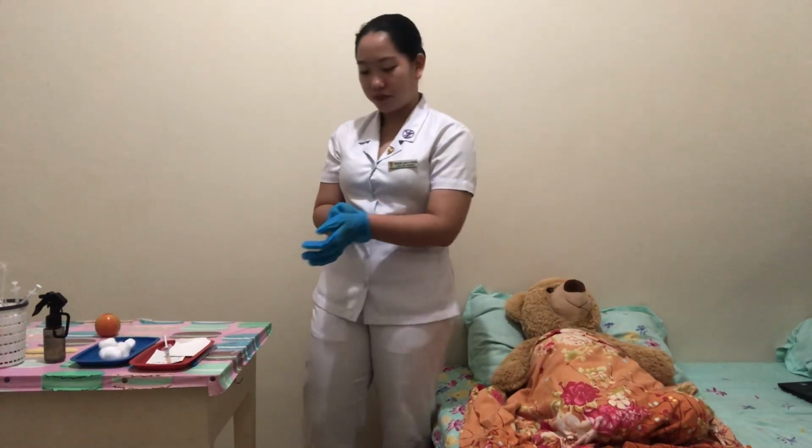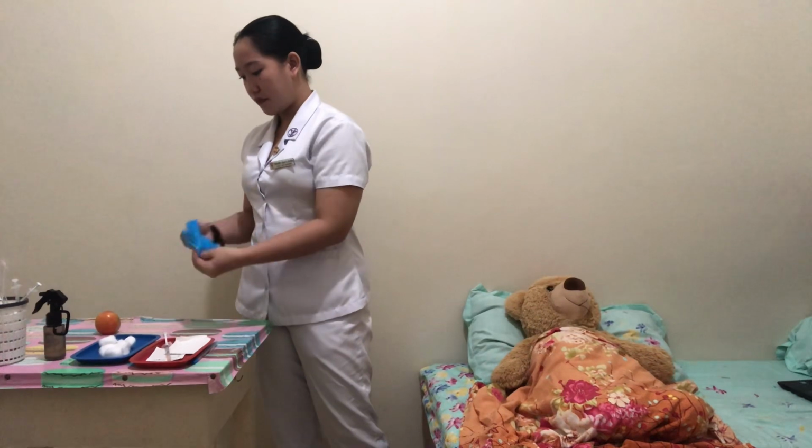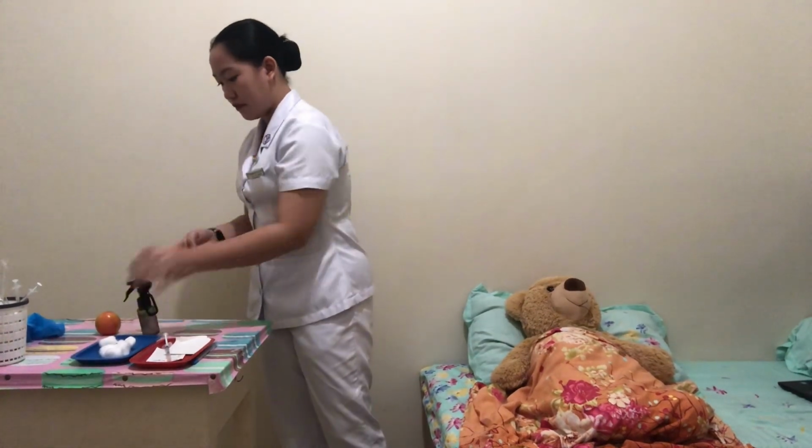And now remove gloves and dispose of used items in appropriate waste receptacles to avoid needle prick injury, and then perform hand hygiene and assess the effectiveness of the medication at the time it is expected to act. And now document all the procedures, including medication given, dosage, time, route, and any assessment.